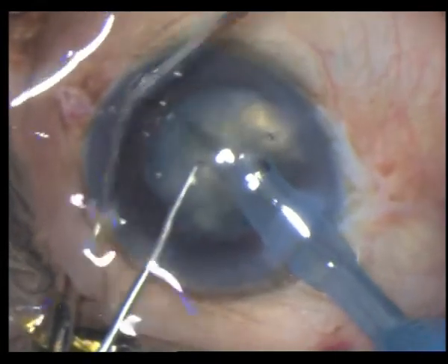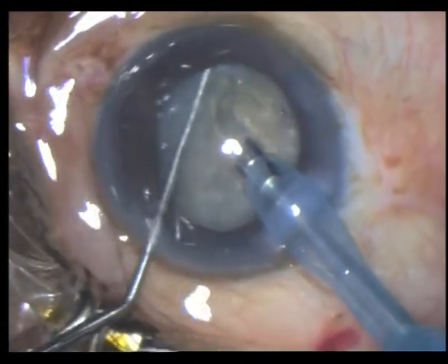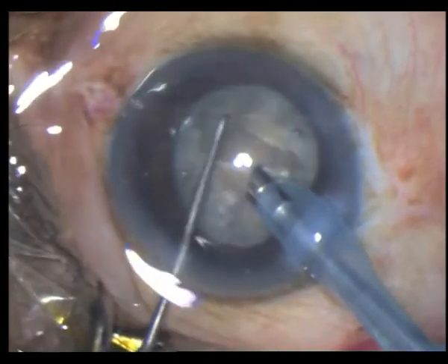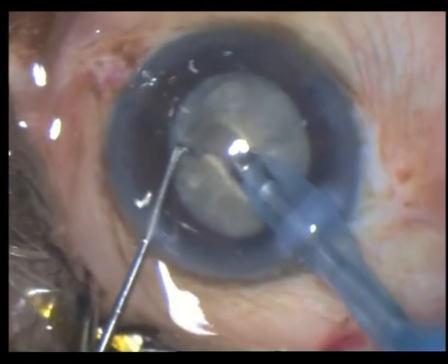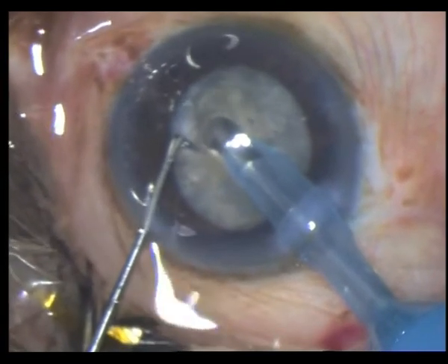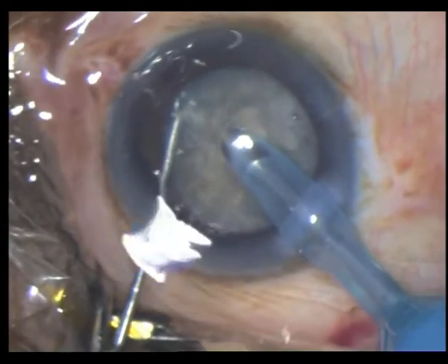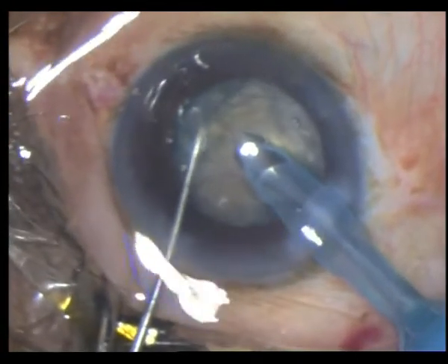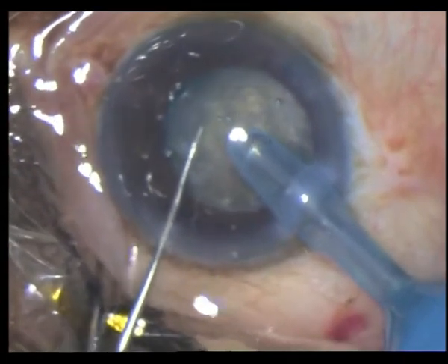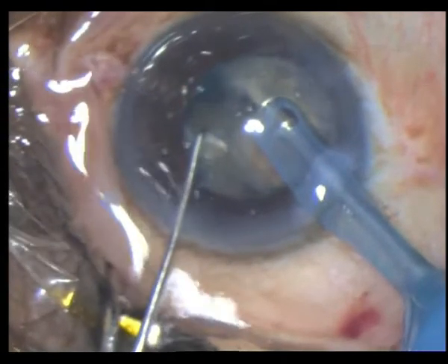Even if you don't get the first chop to your liking, just go ahead, rotate and keep at it. You have to make sure that the tip is very well buried. Go to the mid-periphery with your chopper, bury as deep as the tip has gone in, then engage phaco, go towards the tip and laterally separate. And that's a good chop.